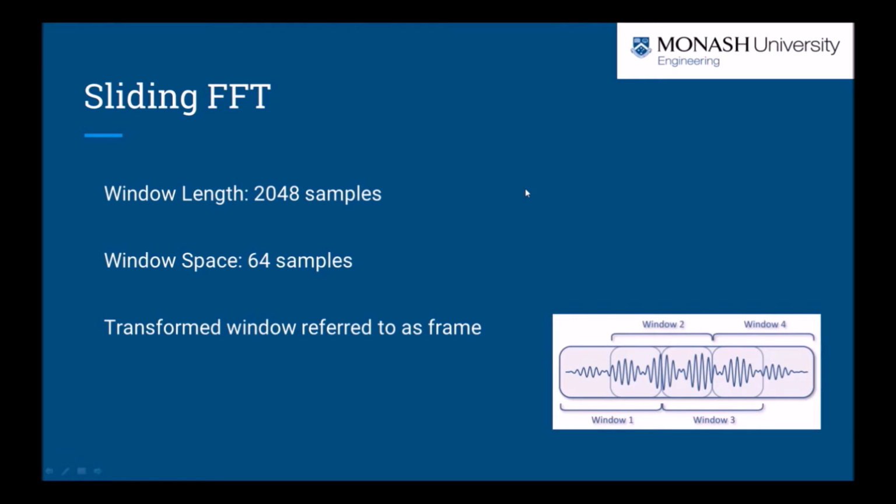To create a spectrogram, we take multiple fast Fourier transforms in an overlapping sliding fashion along the recorded signal. Each FFT contains the frequency spectrum of the recording for the given duration of the window. The frequency content gives us important information on the signal and characterizes the specific sounds in each murmur.